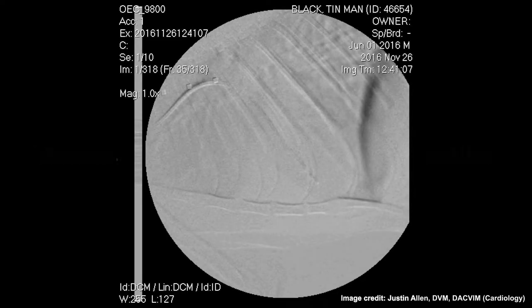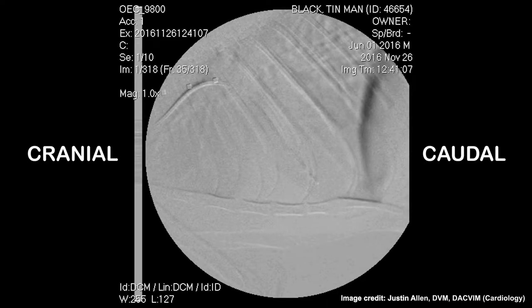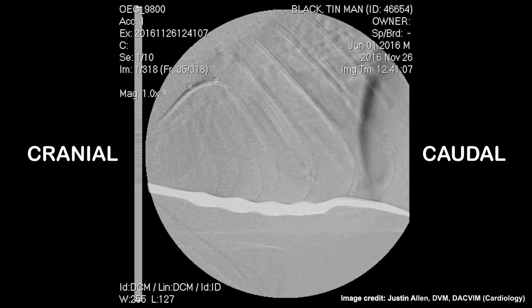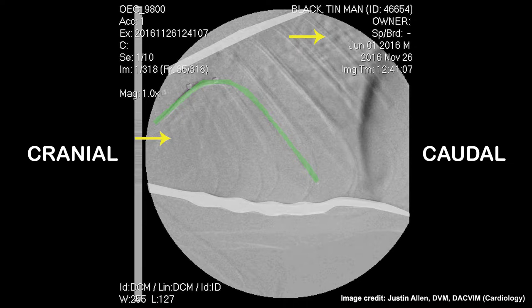In this image, the fluoroscope is positioned to generate a lateral-lateral image of the chest. We can identify the sternum, thoracic ribs from T2 to T9, and part of the thoracic spinal column. A catheter is inserted into the left jugular vein with the tip positioned at the apex of the right ventricle. A measuring catheter is also inserted into the esophagus with markers that are 1 cm apart to guide the cardiologist during the procedure.